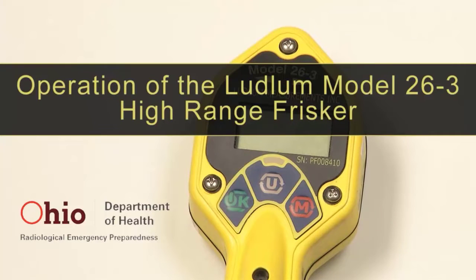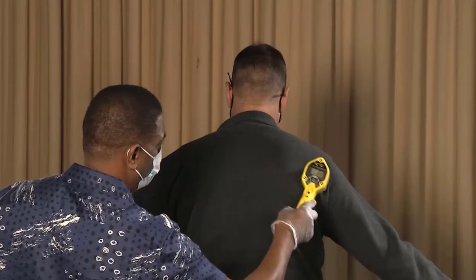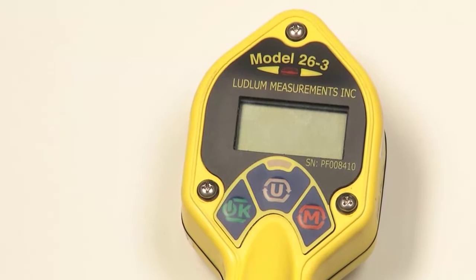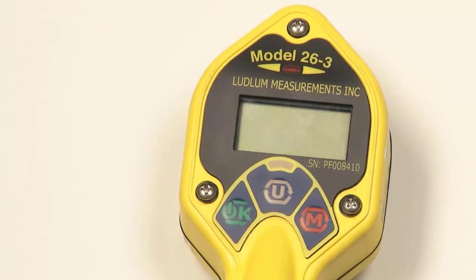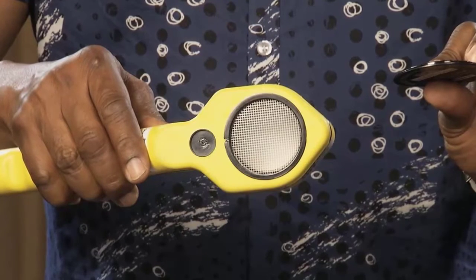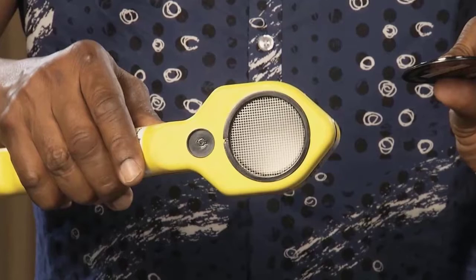The Ludlum Model 26-3 is an ergonomic, lightweight instrument which can be used for alpha-beta contamination frisking or for measuring gamma exposure. It features the ability to measure radiation in count rate, exposure rate in dose, and scalar counts. The Model 26-3 utilizes a standard 15 centimeter squared Geiger-Mueller pancake detector which can detect alpha, beta, or gamma radiation.